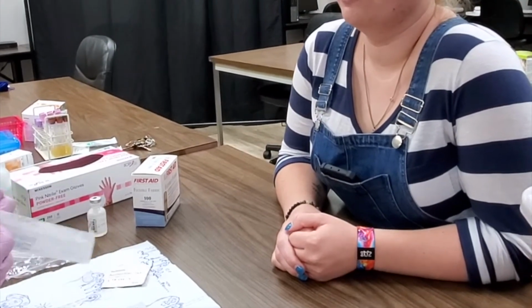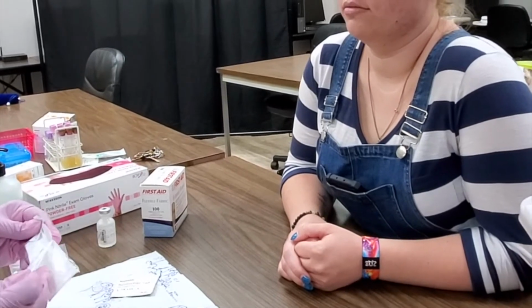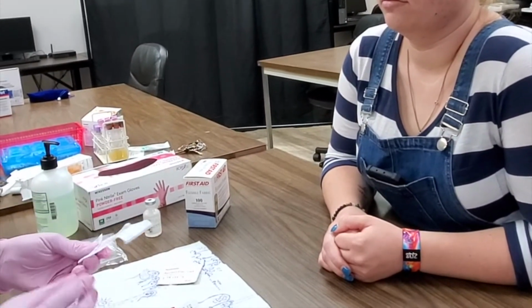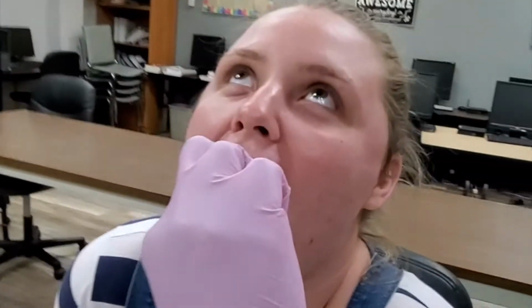So let them know that we're going to put the swab in the back portion of the mouth, around the uvula. That's the portion that kind of hangs down towards the center. And we're going to swab both sides. On the count of 3, go ahead and open up. Say ah. All the way in the back. Okay.